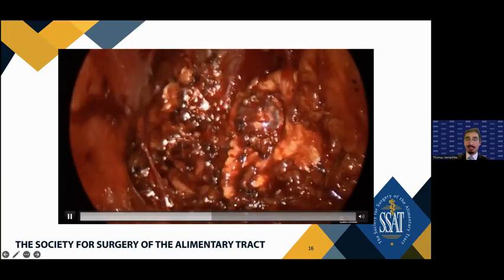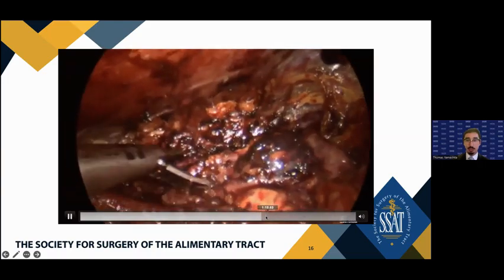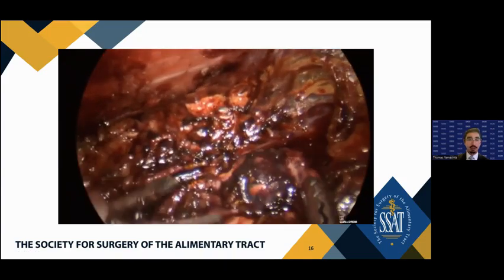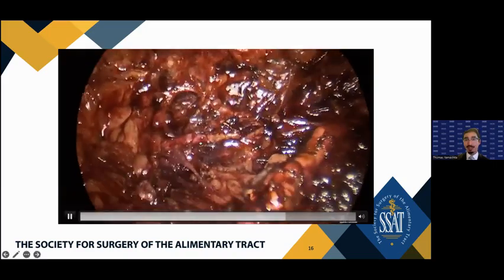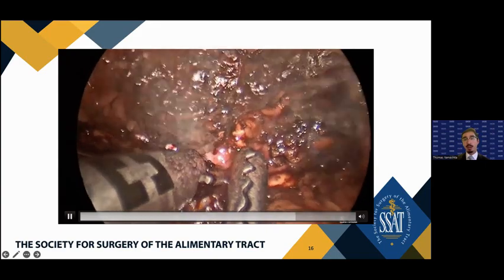And I'm going to skip a little bit to where I'm starting to take the disease or doing the wedge resection. So trying to get some grasp, a little bit difficult there because I didn't leave any tissue for me to have a little handle. But once I get the angle, you can see the IVC, not fully dissected on the back right there, also collapsed. I start taking it with the harmonic and just go across it.